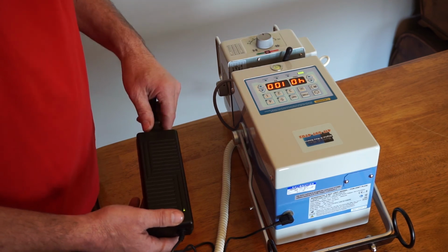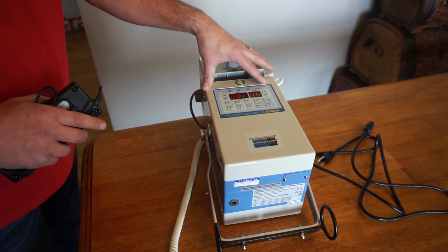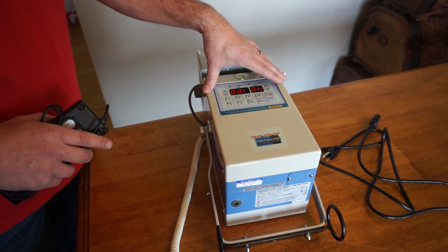So it's charged fully. If you find the batteries at 30% or below, or at 2 bars, you need to charge immediately. Anything under 30% can do damage to the machine at that point.